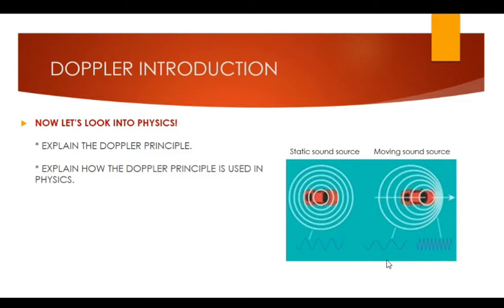And that's the main basic Doppler principle. So how does that relate to blood? It's a similar principle. So echoes from blood moving towards the probe are going to be returning at a higher frequency, and echoes from blood moving away from the probe will be returning at a lower frequency. And that's how the machine knows whether to make the blood blue or make the blood red on your screen, but that can be inverted. So we will go into that as well later, but just keep that in mind.